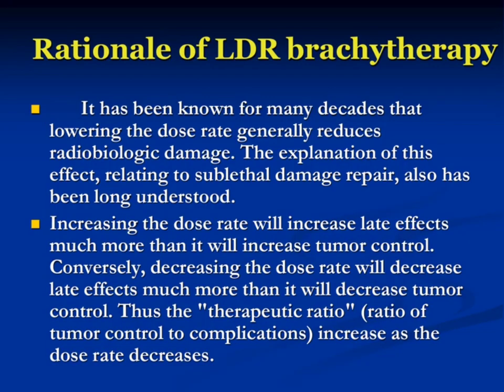So you see here in figure A, you see the two planes, one plane and two plane, and then you take the midpoint and the center, and you decide the basal dose rate in the first triangle. And the second triangle, in the second plane, the double plane, you make two triangles, so that you take basal dose rate 1 and basal dose rate 2, because of the two different triangles, and then take a mean. And the second figure explains that the source axis should be vertical to the plane of the implant.